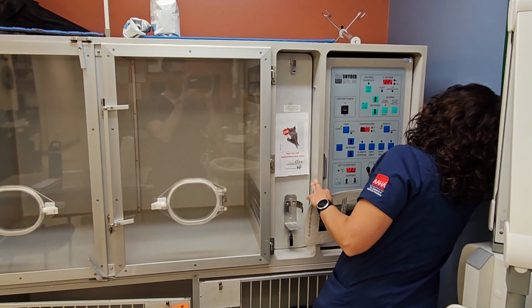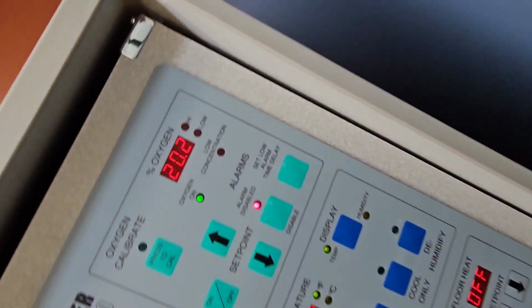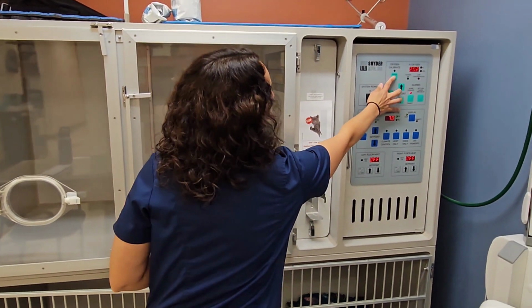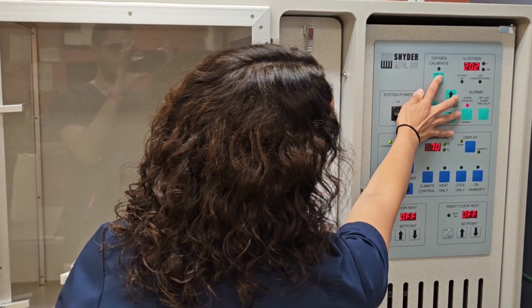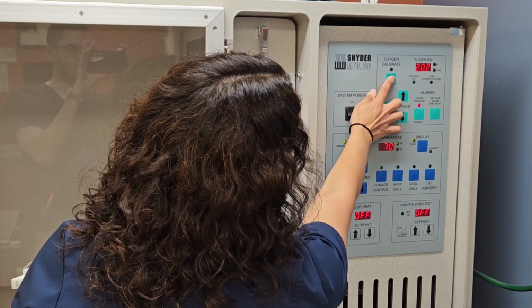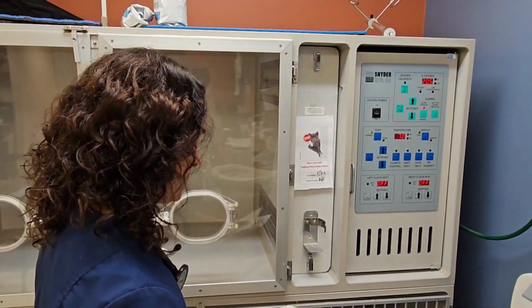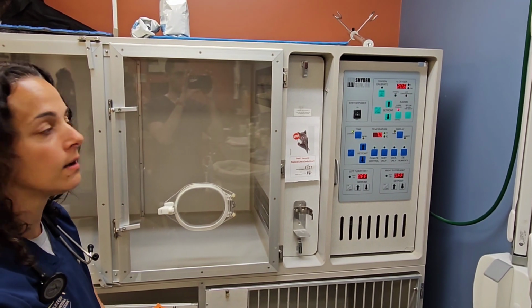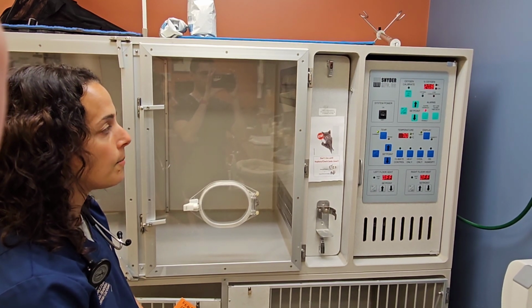now I'm going to turn the oxygen on. I'm going to turn the little dial so that the ball is up to the 15 at the top now. I'm going to press this calibrate button. I have to hold it down for some time until there's a blinking that happens. It might be 10-12 seconds. So everything kind of blinked a little bit. So the machine is going to calibrate. And this number here, 20.5, is going to go up to 33 during the calibration. So now we just have to wait, and it'll be fully calibrated when it's up to 33.